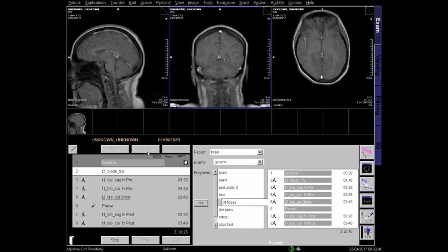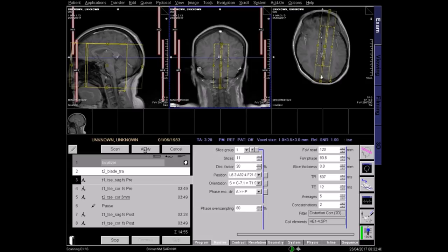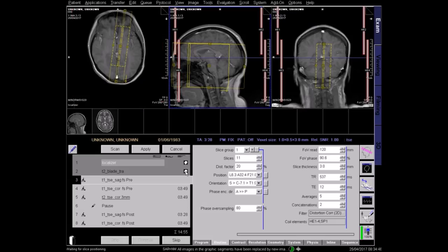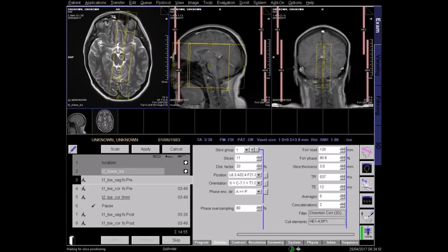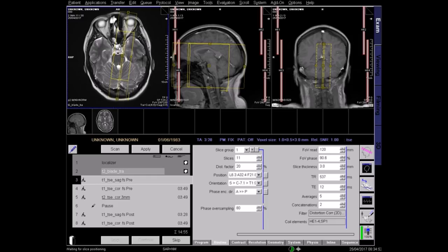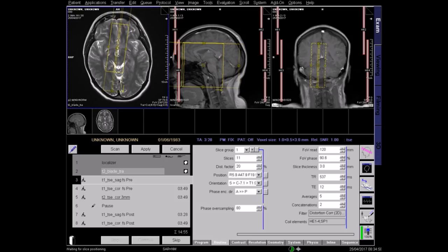The next sequences are high resolution, small field of view images of the pituitary gland. Now let's plan the T1 sagittal fat-saturated sequence of the pituitary gland, using the acquired axial image. Angle the positioning block parallel to the midline of the brain.